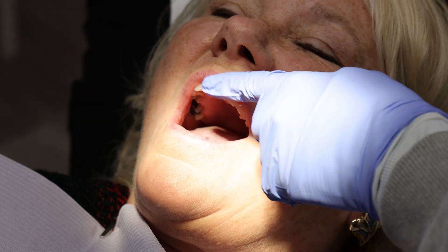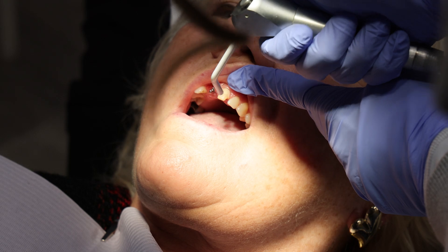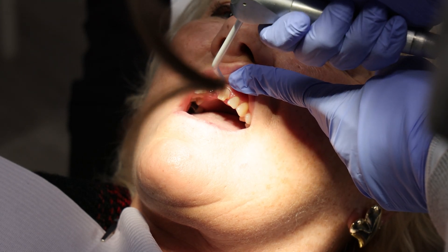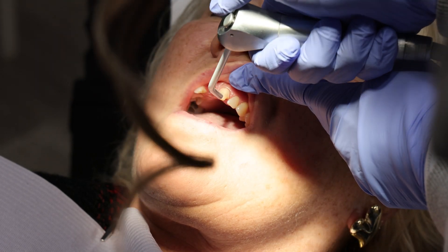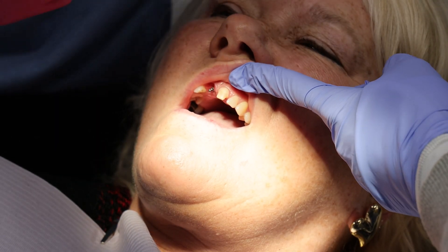Ready when you are. Alright. Go ahead and open for me. I'm going to blow a little air there, okay? Let me know if it's too uncomfortable. When I put it in, I'm going to push a little hard, okay?